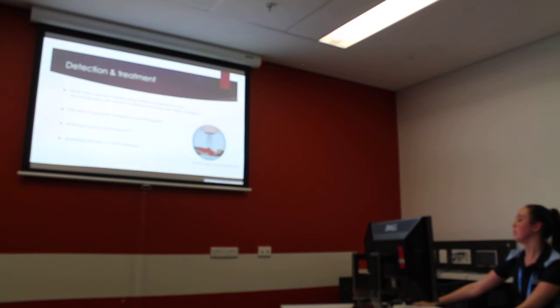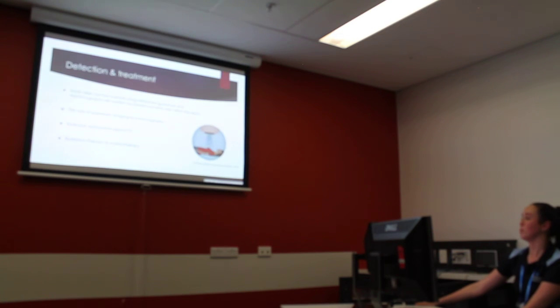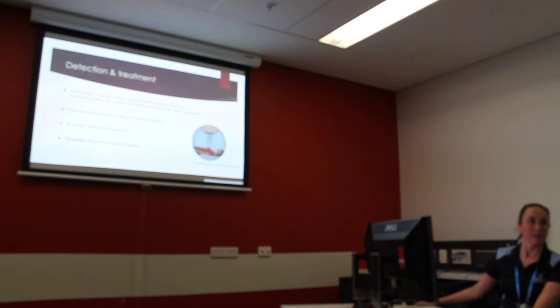In the case of a suspicious lesion being identified, it is likely to be biopsied under ultrasound guidance. If the patient's healthcare team makes the decision that the lesion needs to be removed, a hook wire will be inserted again under ultrasound guidance and localised in mammography prior to their surgery. So depending on the size and aggression of the singular or multiple lesions, a lumpectomy or mastectomy will be conducted. A lumpectomy only removes the lesion, where a mastectomy removes the entire breast and sometimes the lymph nodes as well. Generally, they will if the cancer is aggressive and invasive enough too.